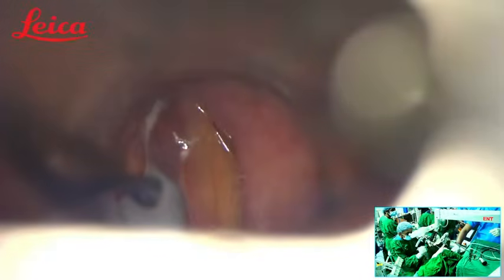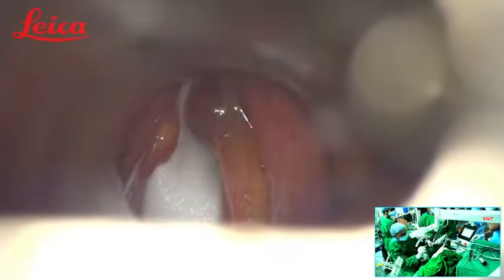Injection. So with the instrument you can just palpate the lesion so that you will get to know whether it is deeply attached or just above the mucosa. So this is a polyp from that area. So you can go ahead.